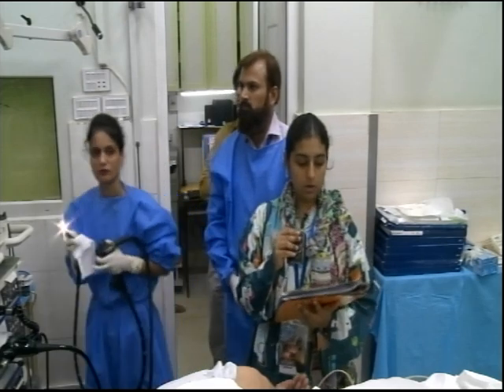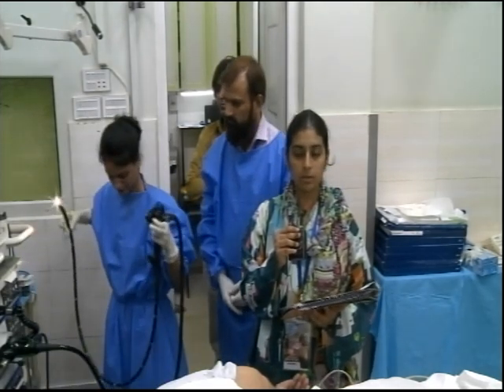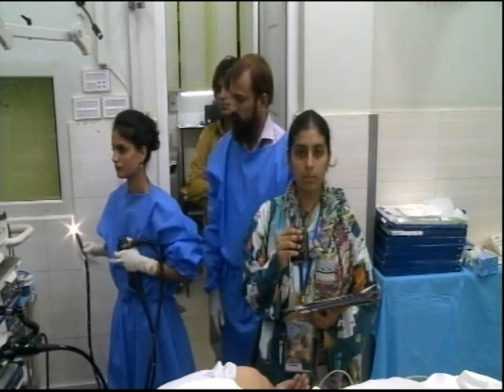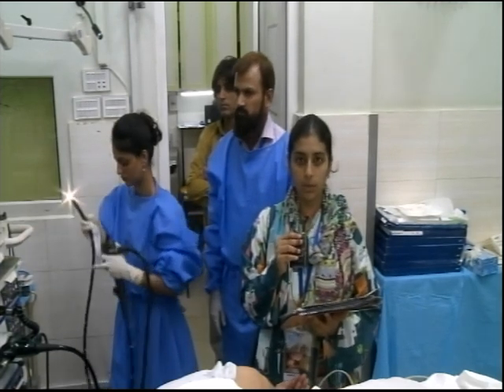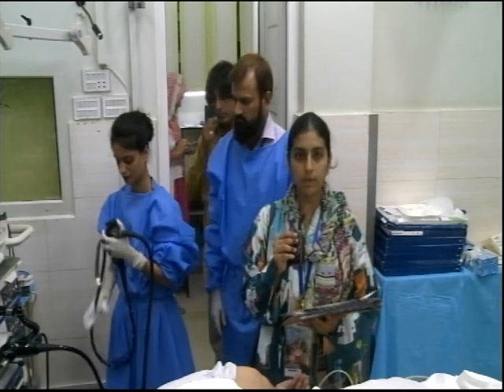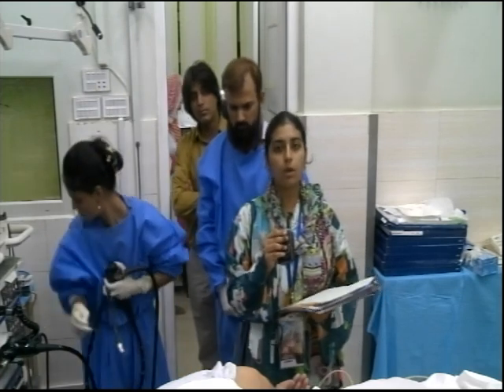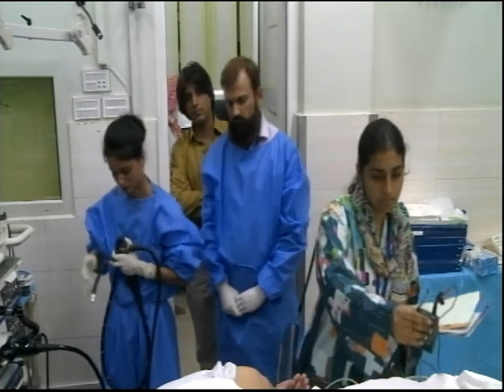Okay. The next case that we have is of a 40 years old female who presented to us with complaints of abdominal pain and weight loss for past 3 months. Her CT scan shows a mass in head of pancreas of 2.8 into 2.4 centimeters. For evaluation of that mass, we are doing this EUS.